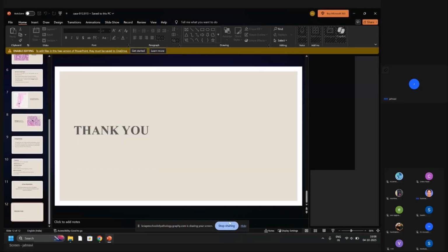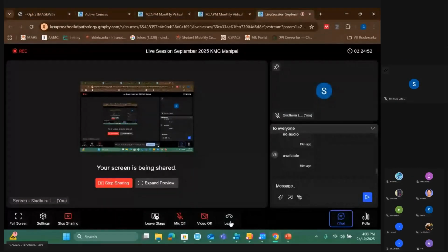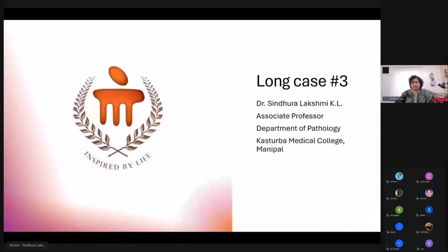Thank you, Dr. Janvi. Now I call upon Dr. Sindhura Lakshmi, Associate Professor of Pathology, KMC, to discuss this case. Okay, am I audible, ma'am? Yes. Okay. So, thank you, Dr. Janvi, for a nice description of the case. So, we are discussing long case number 3.